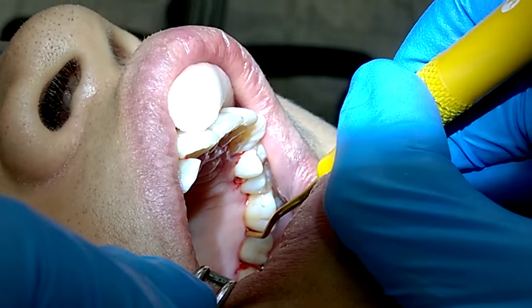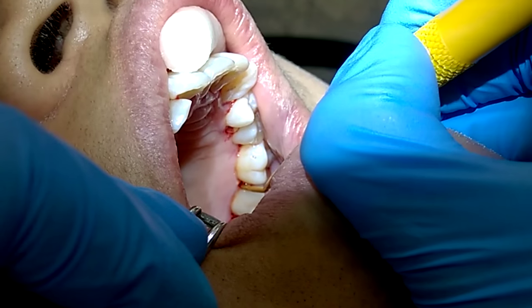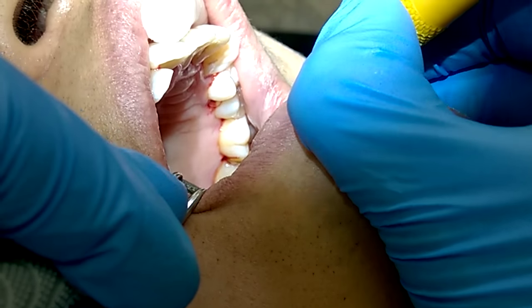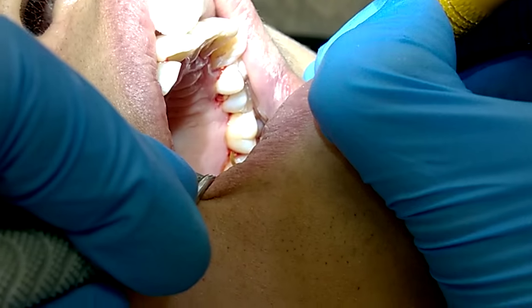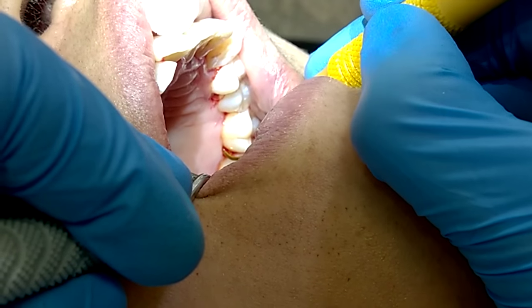I'm using an extra-oral fulcrum during this periodontal therapy procedure. I've already used the power-driven scaler throughout the quadrant. To complete the quadrant, I'm using the double Gracie. It transitions easily to scale all surfaces, and it is very convenient not having to switch between two instruments to complete one tooth.